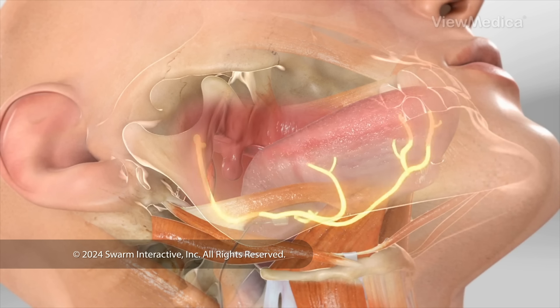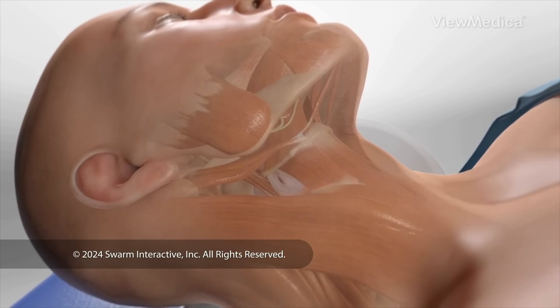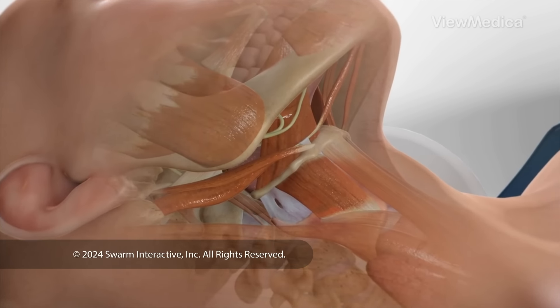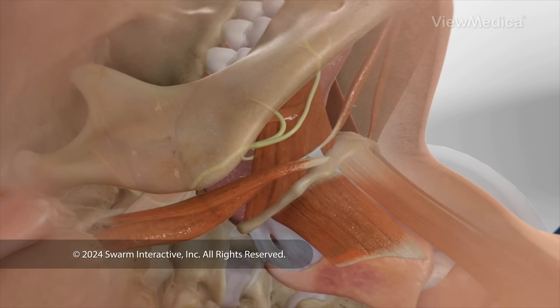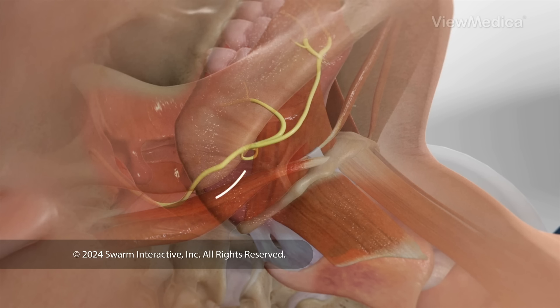Here's how we implant the parts of this system. To begin, we put you to sleep and clean the skin of your chest and neck area. First, we need to reach the hypoglossal nerve — it controls your tongue's movement. We make a small cut under your jaw to get to this nerve.